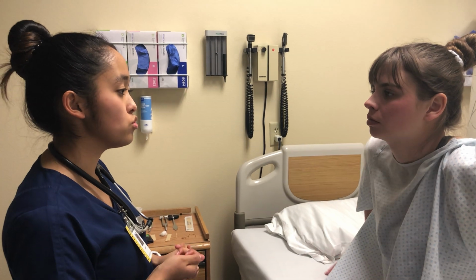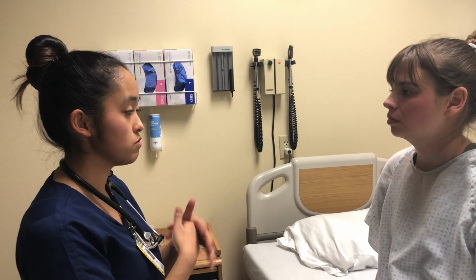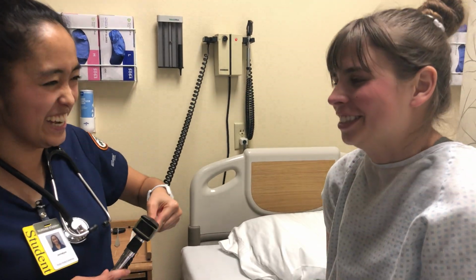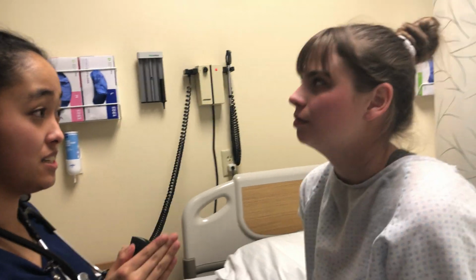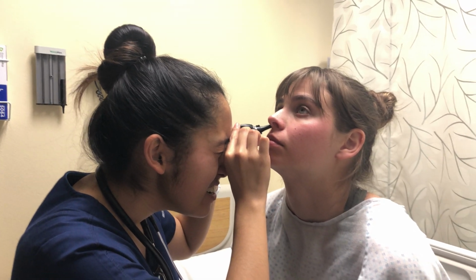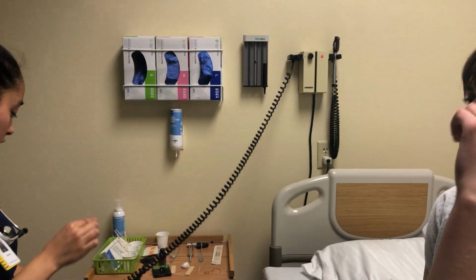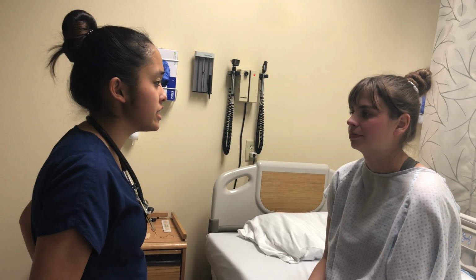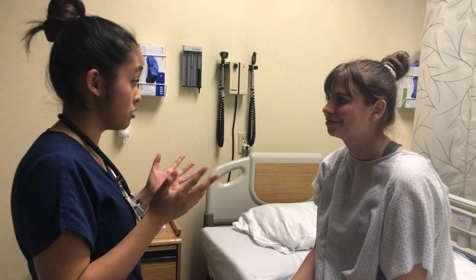The next thing I'm going to do is move on to your nose. I already tested for nose patency, so I'm going to take a look up in your nose to make sure everything looks good and healthy. All right, look up for me. Oh, I also see that your septum is midline. Let me know if this hurts. Okay, I'm going to look at the other side now. All right. So what I saw on both sides is that your septum is intact. There was good, nice pink-red color in there. I didn't see any edema, no abnormal discharge, and it all looked good.